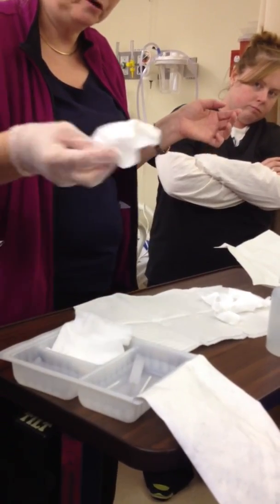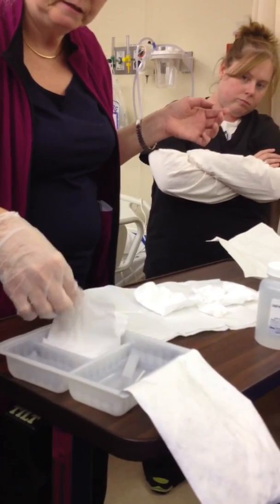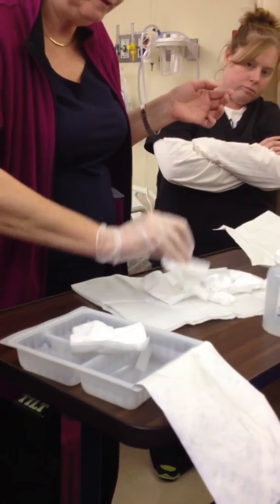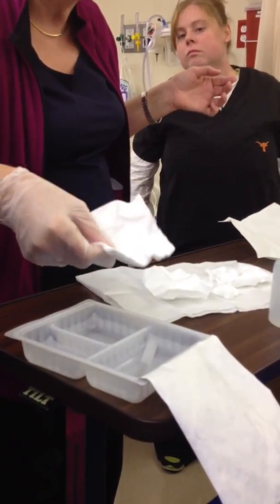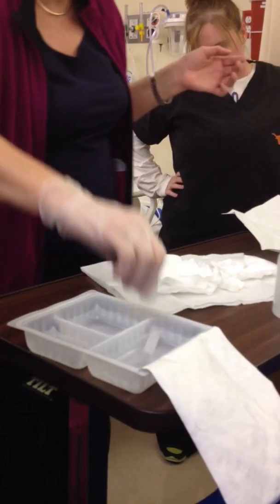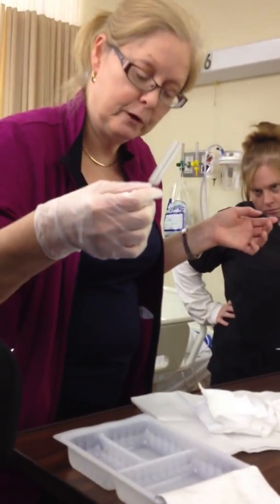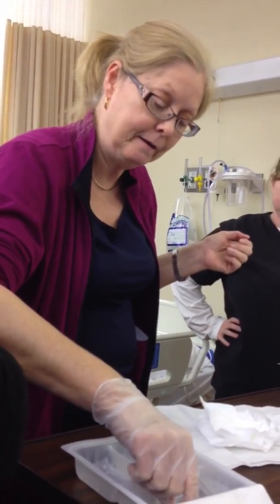And then here's the gauze dressings, which they're kind of always stingy with. There's one, there's two. Is it opened up? And I think you got 4. Yeah. Okay. So there I've got 4 little gauze dressings, and then here's my little pipe brush that we're going to scrub the trach with once it's out. So I'm going to leave it right there.